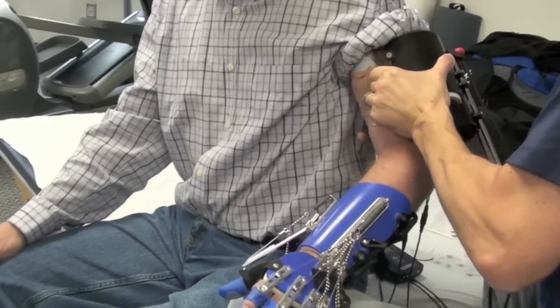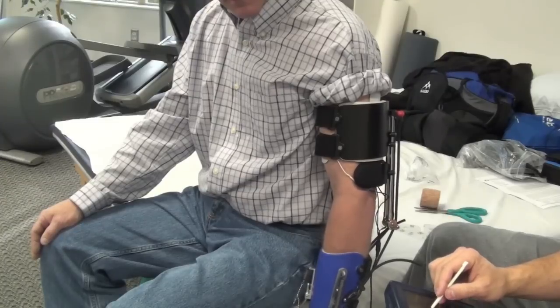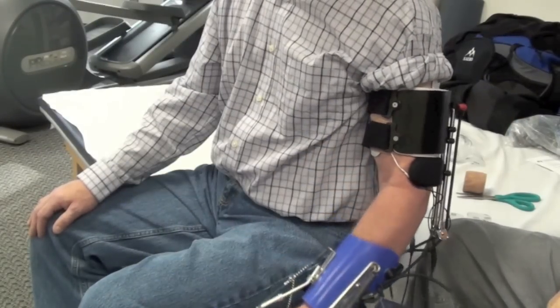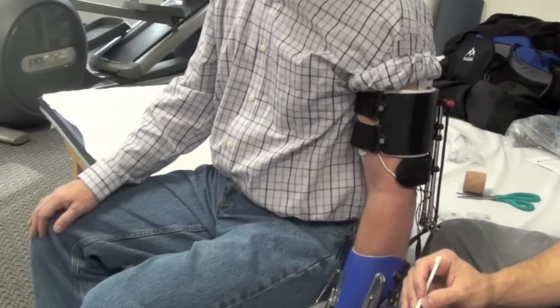Once you apply the above elbow cuff, turn the stimulation on to stimulate the triceps, as well as set the activation and deactivation thresholds for the biceps. Then you'll test to make sure the patient can exceed the activation threshold and then relax the elbow to fall below the deactivation threshold.